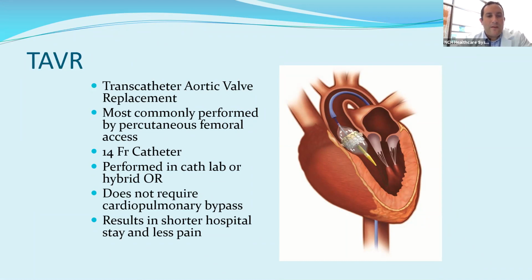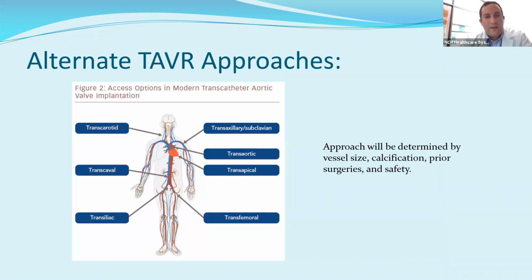Does not require the patient to be on bypass, does not require an incision in the chest, and really results in a shorter hospital stay and less pain. Patients generally wake up from this procedure having no pain and generally are home the next day or the day after. It can be done through multiple approaches. This is going to be determined by the patient's vessel size, calcification, prior surgeries, and the safety.